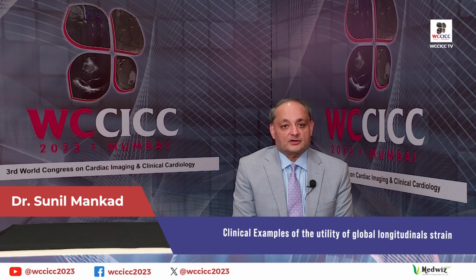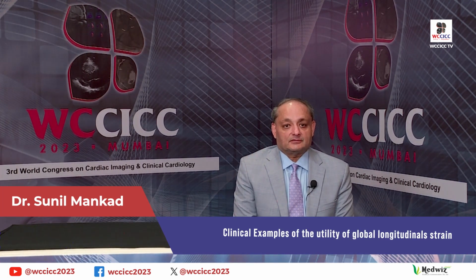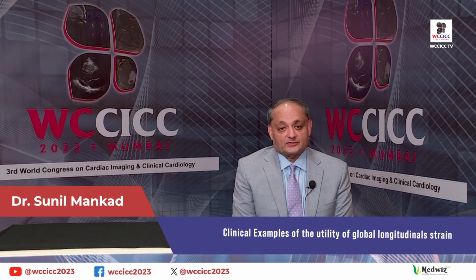Certainly in infiltrative cardiomyopathies such as amyloidosis, it plays a role not only in early identification of cardiac involvement, but also in prognostic importance of the abnormal strain values.